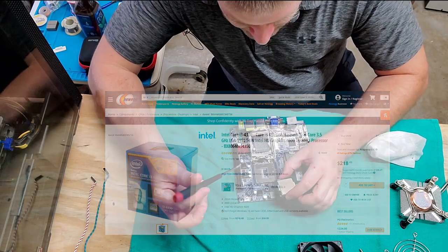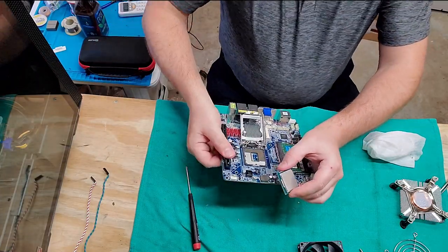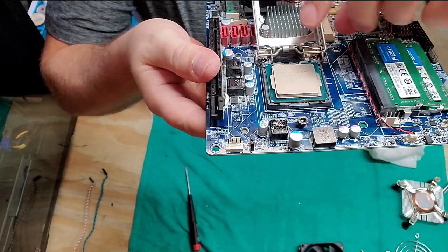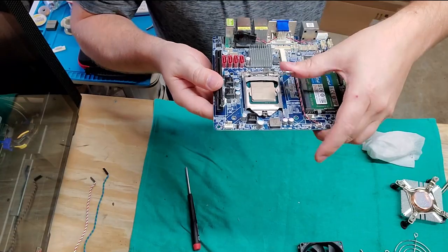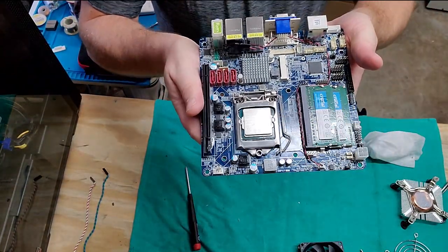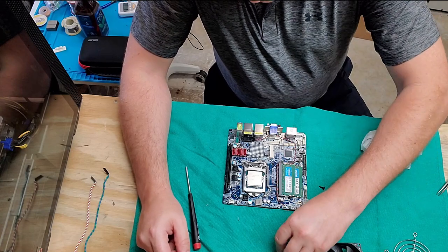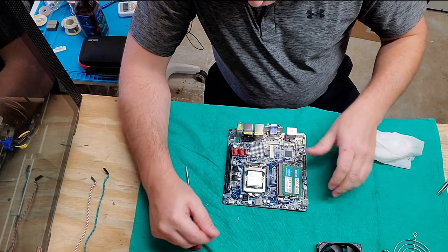So there's two alignment ears. You can see one of them right here and right here. And those two alignment ears match up with the alignment gaps in the CPU. And all we do is push that down and lock it in. And here we go. So that guy's gonna go on there. I will clean this guy up, put some better thermal compound on it, and I will give this guy a run for its money because I bet you it's absolutely fine.